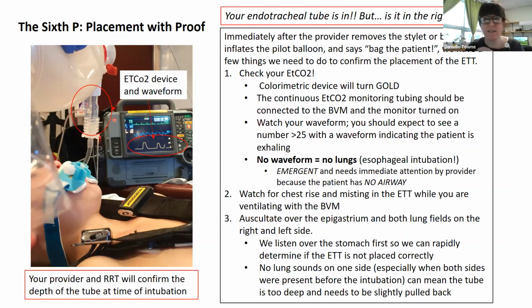Some just go right to the continuous end tidal CO2 monitoring, and that is the gold standard that we connect them to. What we're expecting to see is a waveform, and when we see that waveform, we're expecting to see a positive number with that, because that's indicating that the patient is exhaling. So every time we breathe for them and then we release the bag and they exhale, we should see a waveform and a number associated with that.